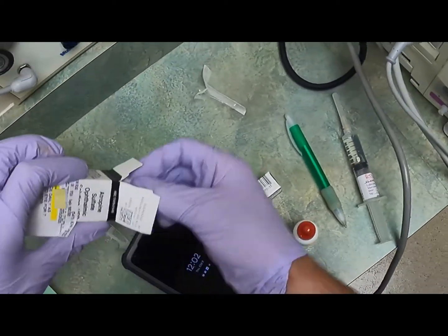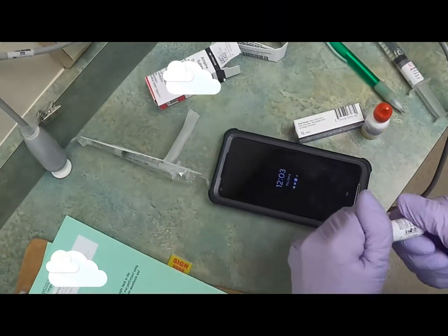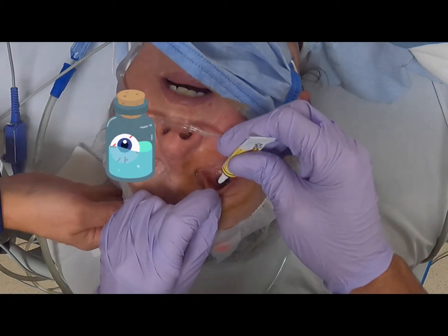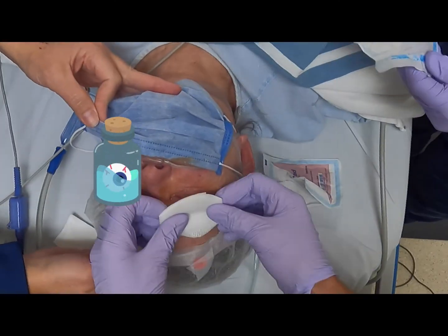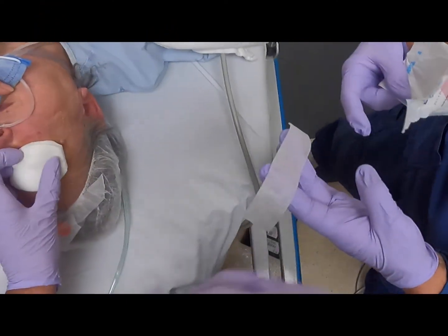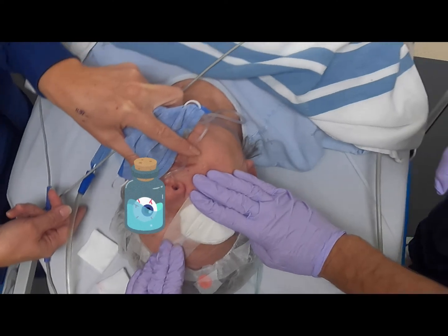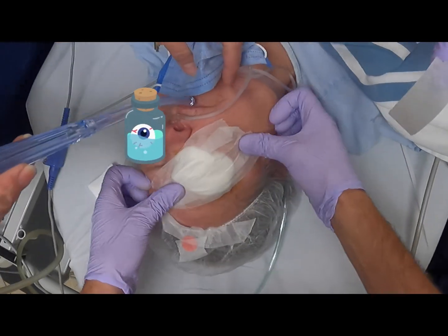We're going to do a drop of atropine for comfort, and then Maxitrol — a little bit of Maxitrol ointment, and then a pressure patch.